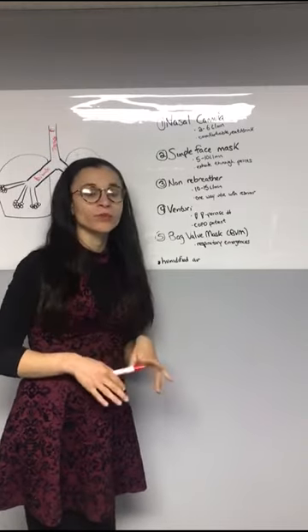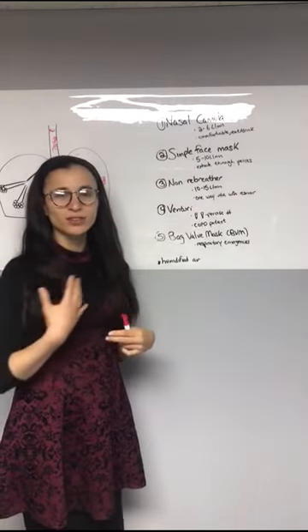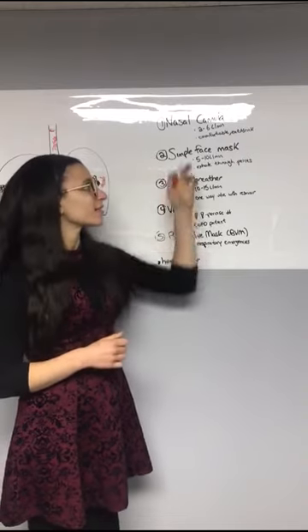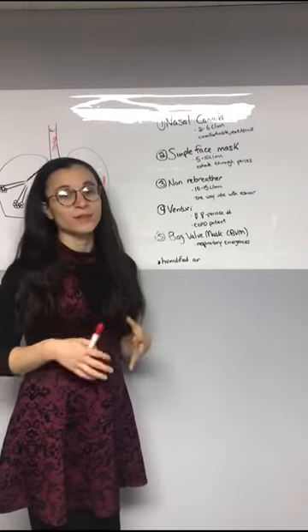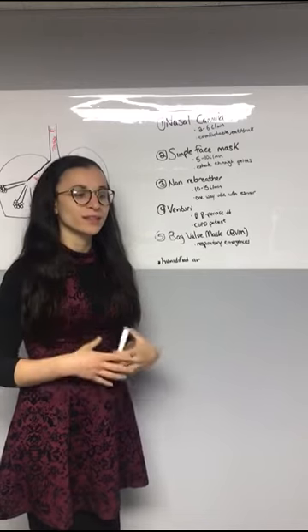So in general, with patients on oxygen, oxygen dries and makes the mouth dry. So you want to give humidified air with it. Maybe not the nasal cannula, because that's a short-term thing, and it's only through the nose anyways, they can breathe through their mouth. But the other ones, you want to give them some humidified air so it doesn't dry them out.